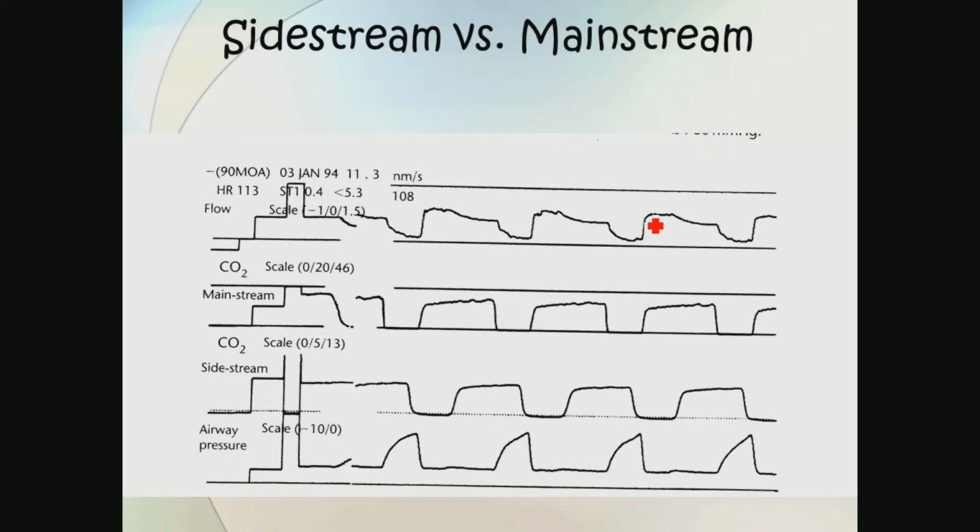Here's an example of a sidestream and a mainstream. So this is, let's see, I got this correctly here.